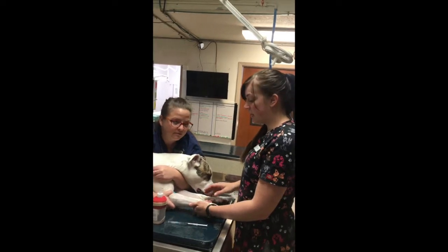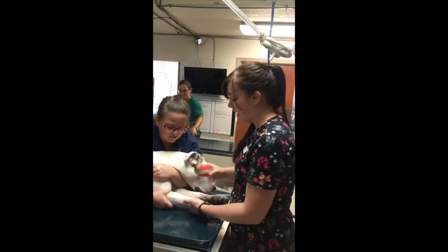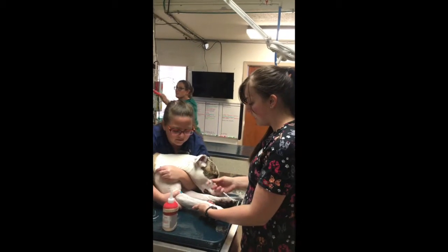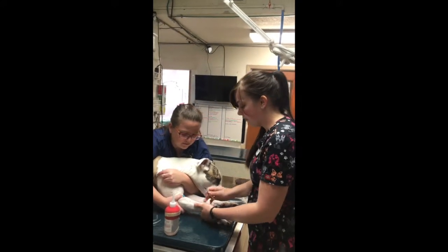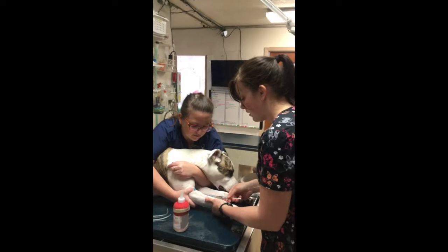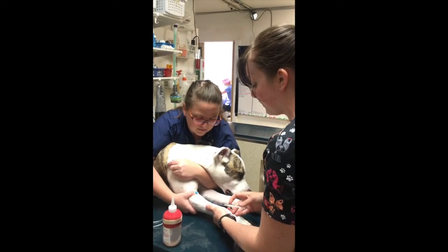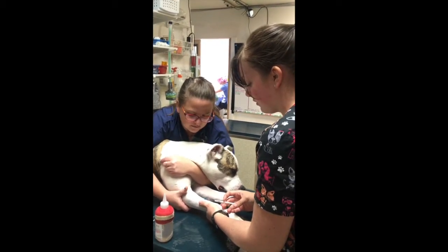Alright, so I'm going to be doing an IV induction for surgery. This is Tilazol for this patient. I have my preceptor, Dr. Neese, holding off the vein. I'm going to apply some alcohol over the skin. I'm going to go ahead and remove the cap off my needle. Make sure bevel side is up. Insert my needle. Once I get a flash, I'm going to have my assistant let go of the vein, and I'm going to give the drugs.